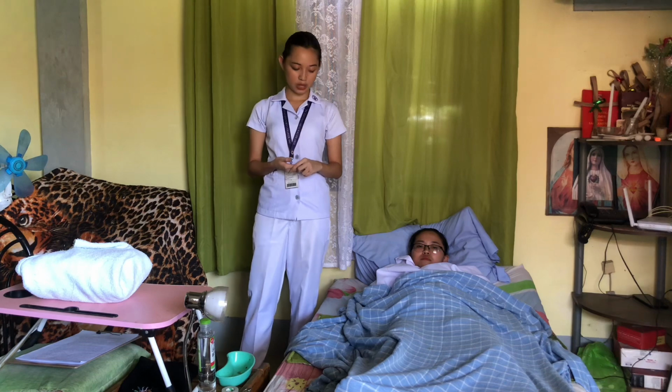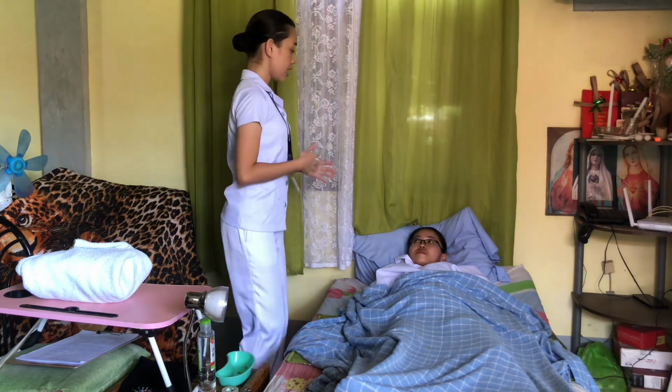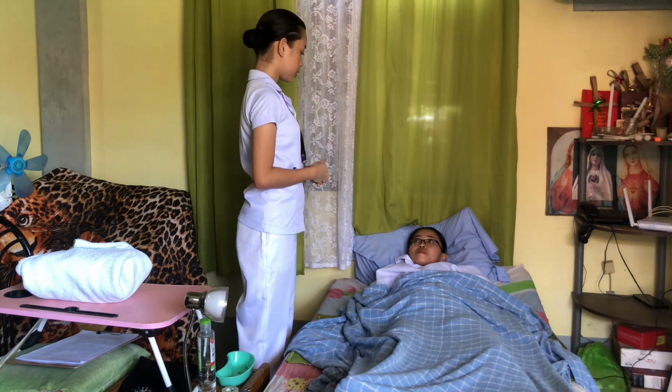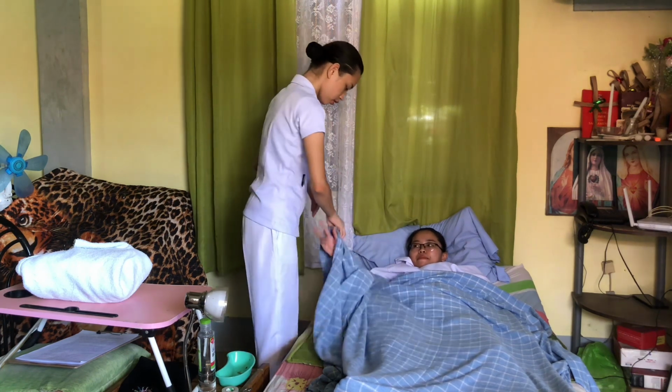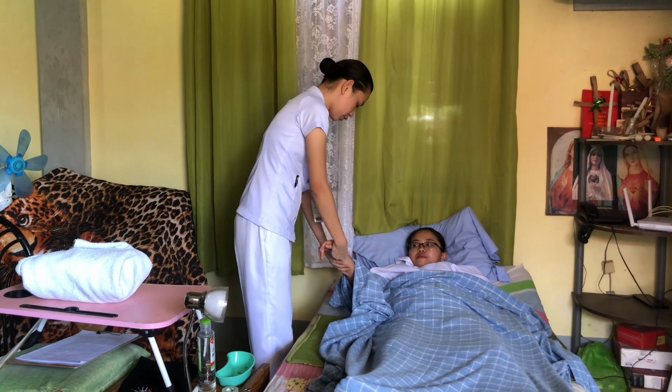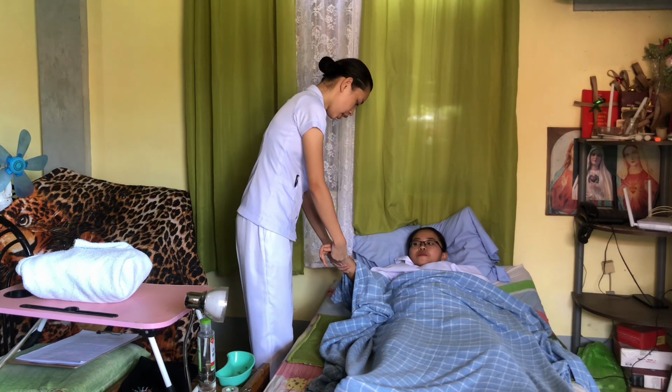Now we are going to introduce ourselves to the client and identify the client's identity using two-way identifiers. This is to ensure we are doing the right procedure to the right patient. So, good day ma'am, I am Nandi Bebs, your student nurse for today. So, may I see your wristband please? Okay, thank you. Can you state your complete name? And your birthday? July 16.